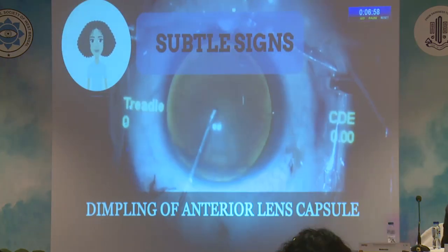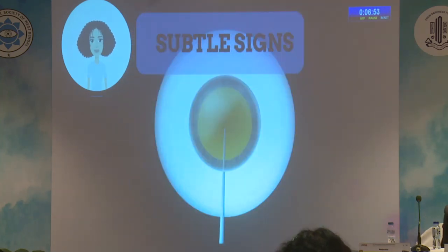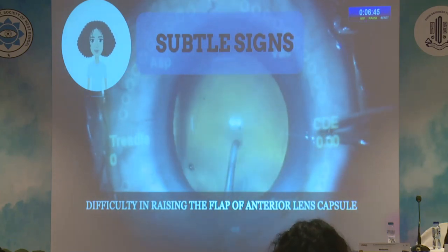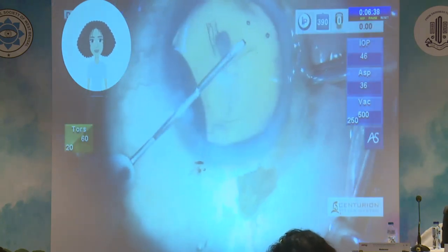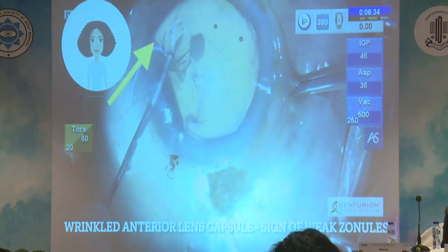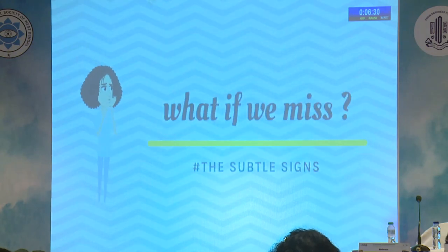There could be certain subtle signs of a zonular compromise that can be picked up early in surgery, like dimpling of the anterior lens capsule during rhexis initiation, difficulty in raising the flap of the anterior lens capsule, and further, while proceeding with the rhexis, wrinkling of the anterior lens capsule can be noticed. At times, these signs could be too subtle to be picked up.